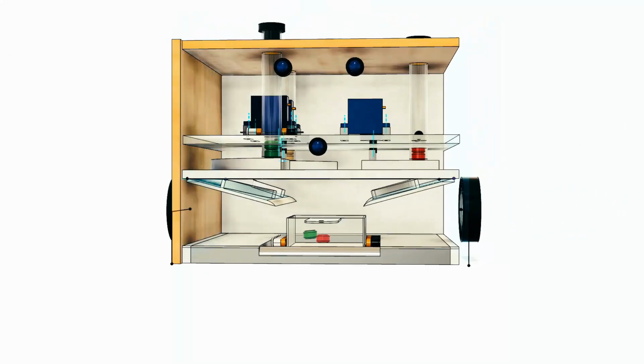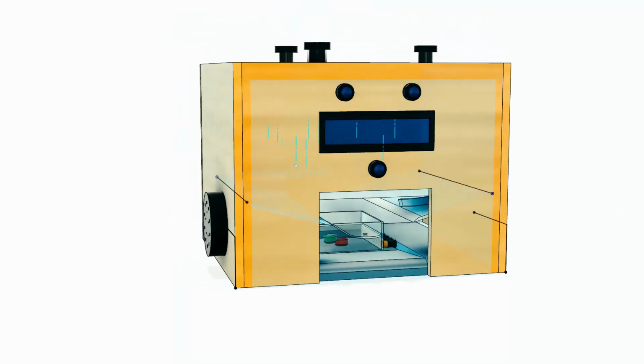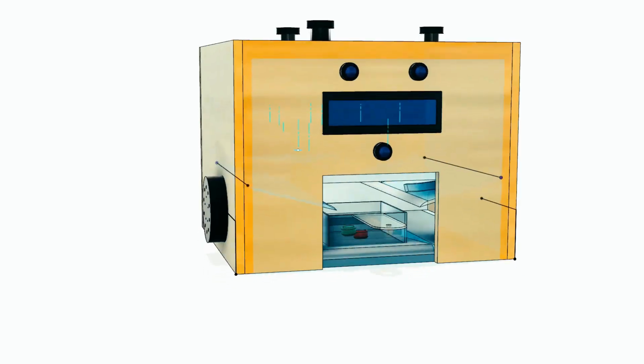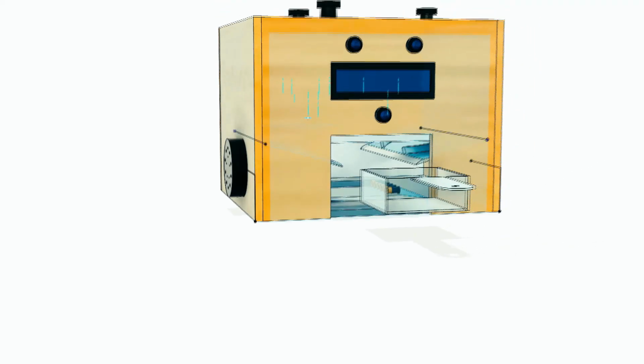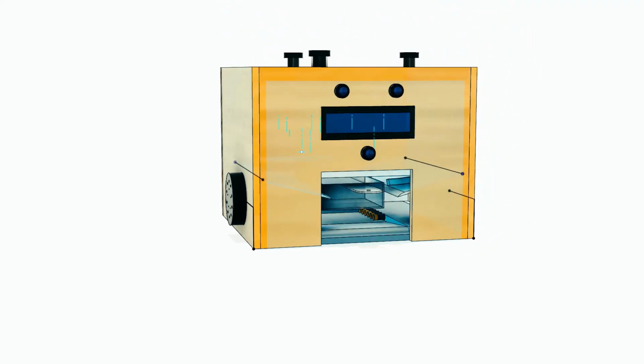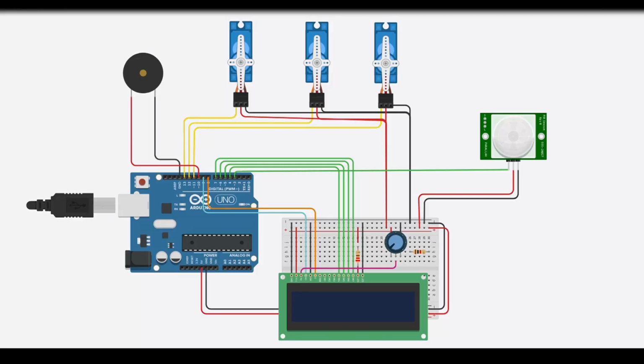Once done and it's time to take the medicine, the device will alert to consume the medicine. Just take out the cup, consume the medicine, put the cup back into place, and it's done. As simple as that. Next, we'll have a glance at how the electrical side of this device works.